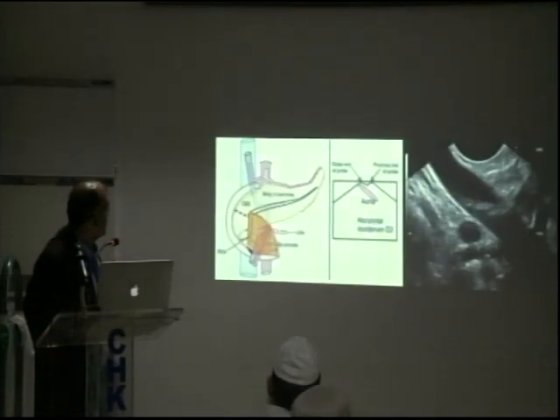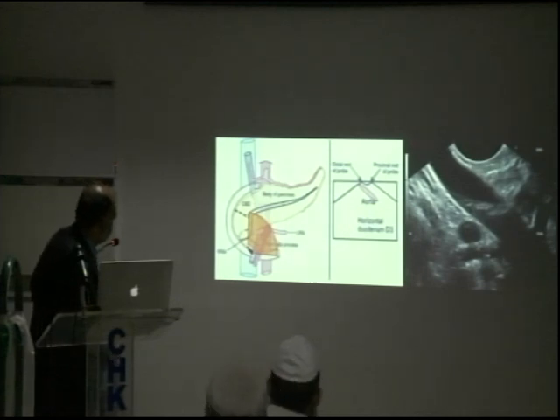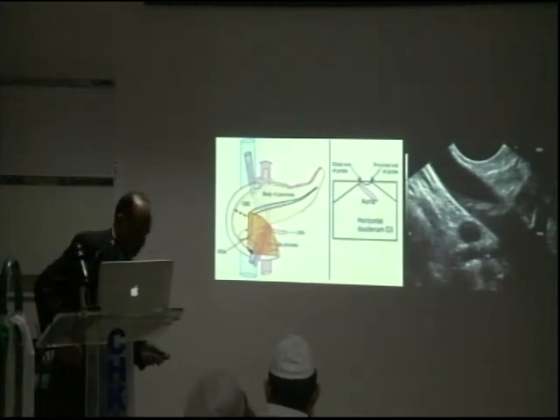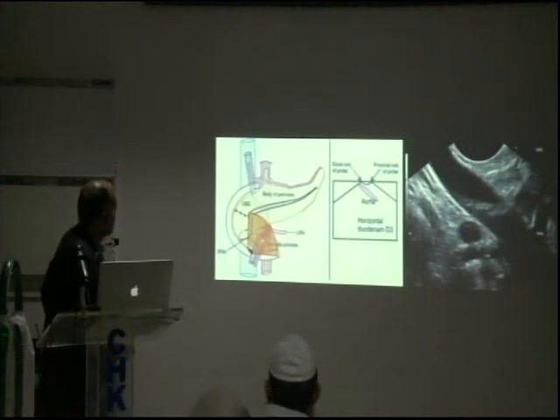Okay. So now just to give you an idea, if you go in the third part, many people do that. The way you want to go is put the scope in, pull it out, pull it together. You can actually go just under that, but this is how the aorta would look like. And you would have this right renal coming out there.